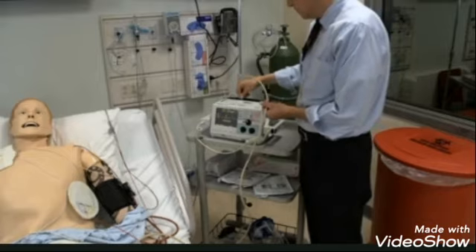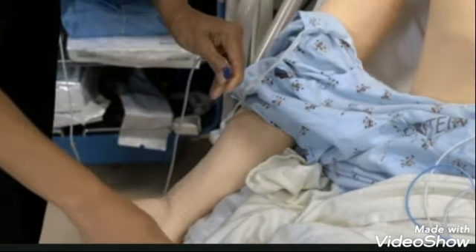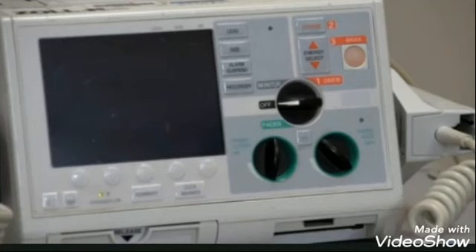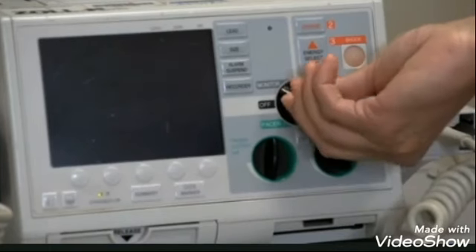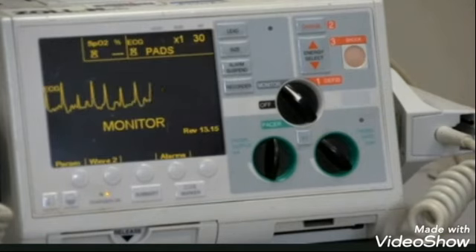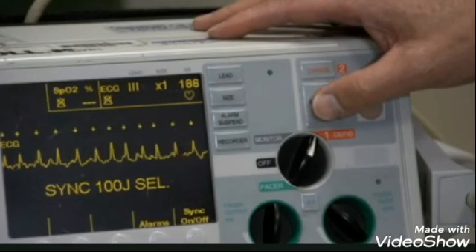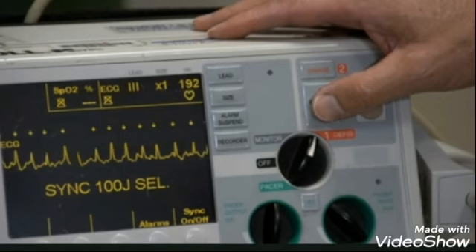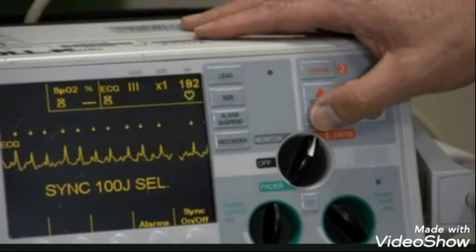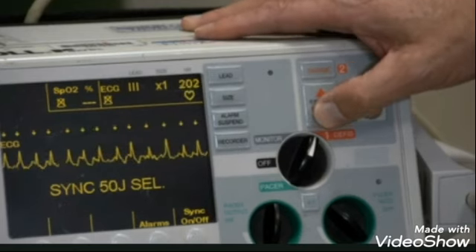Attach the defibrillator cable. Because the procedure is painful, use sedation. Turn the machine on. Ensure that the monitor is on and select a good lead. Select the desired energy level. The recommendations vary between biphasic and monophasic. Biphasic starts with 100 joules and monophasic starts with 200 joules.